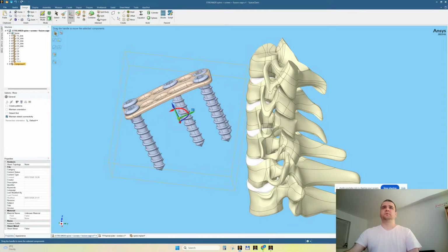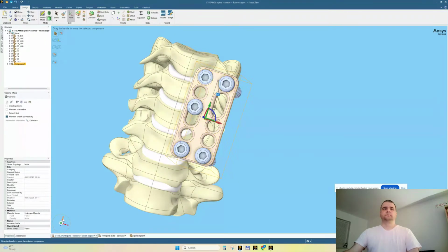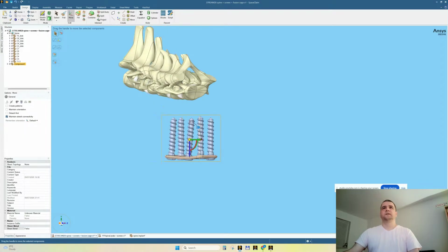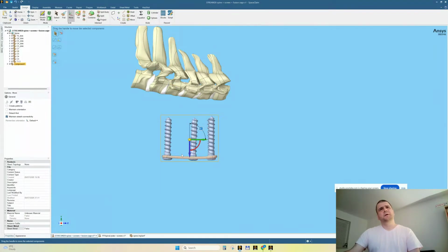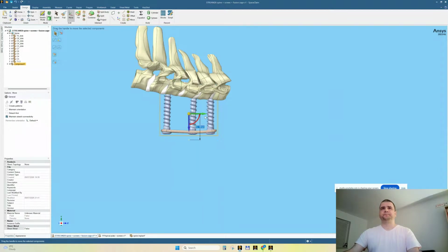Just for fun, let's rotate it maybe 90 degrees. Let's look from all the positions. It's kind of useful and interesting. Where was this? 1, 2, 3, 1, 2, 3, exactly in the middle. All right, let's do kind of the same. This is the so-called middle.